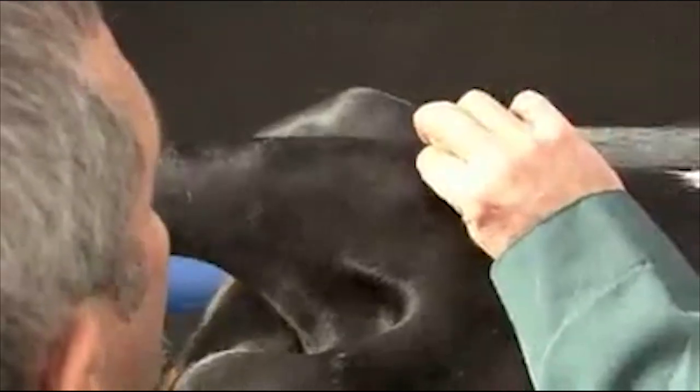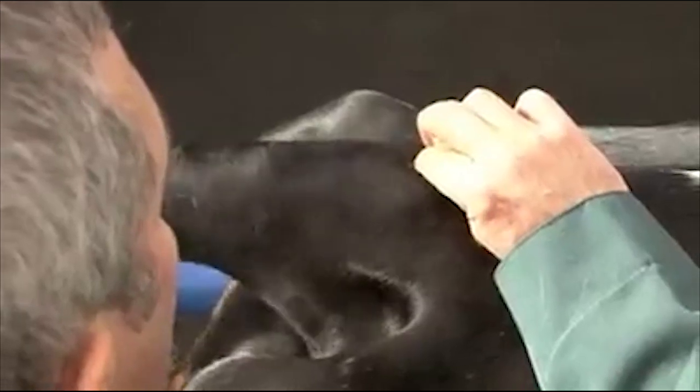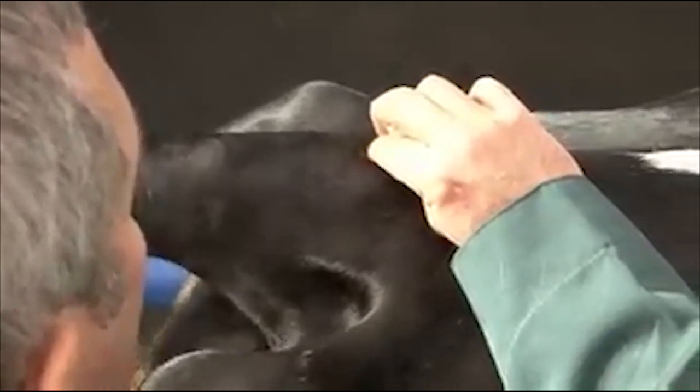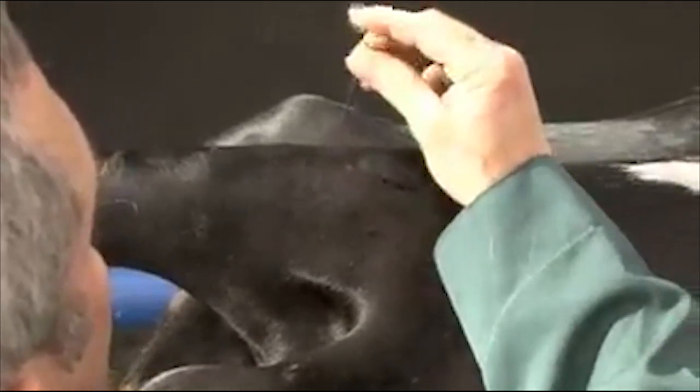An 18-gauge 3.75 centimeter sterile needle is generally used to deliver the anesthetic, except in very large patients who may require longer needles. Locate the space with your finger. Insert the needle on the dorsal midline, directly over the space at a slight caudal to rostral angle to the skin.